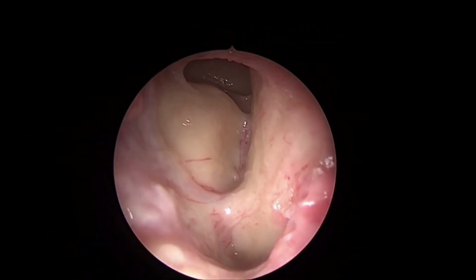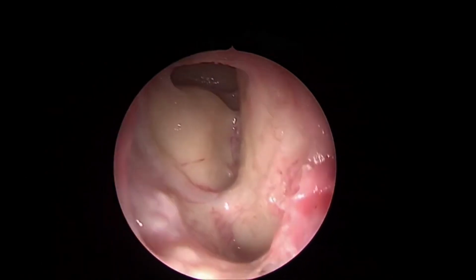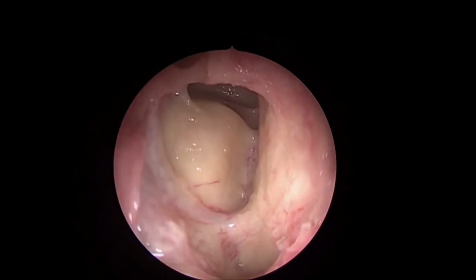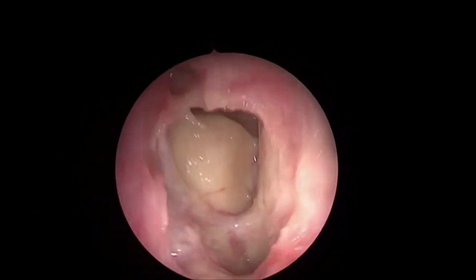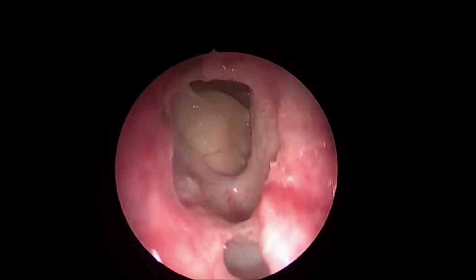And those are the most difficult to treat situations. And that is only because of leaving the raw areas, by extirpating mucosas and allowing the granulations to form a neo-osteogenesis and ultimately narrowing of that region. And that is most difficult to treat.